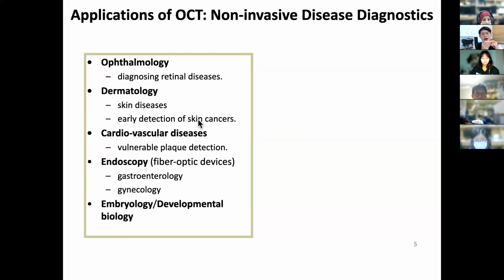Remember, in the coronary artery, there has been atherosclerotic change, which means fatty deposits in the inner layer of the arterial wall, and that forms a plaque. When the plaque ruptures, the patient undergoes a heart attack, and it's devastating, right? And which plaque will be predisposed to rupture or not is a very important question. And OCT can see inside, giving a contrast, so it can be useful for vulnerable plaque detection.